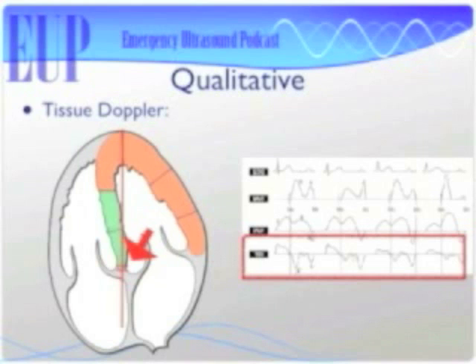So now what am I measuring? I'm measuring the speed of tissue. I'm measuring how fast does that tissue descend during diastole. So it's basically telling me how compliant is my ventricle. That's exactly what it's telling me. The faster my E prime wave is, the faster the tissue's moving and the more compliant that ventricle is. The slower my E prime wave is, the slower that ventricle is relaxing and the tougher that muscle tissue is and the more diastolic dysfunction.